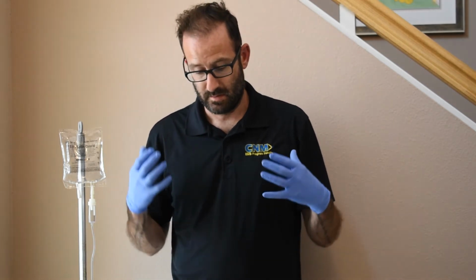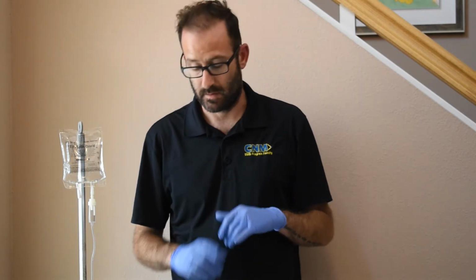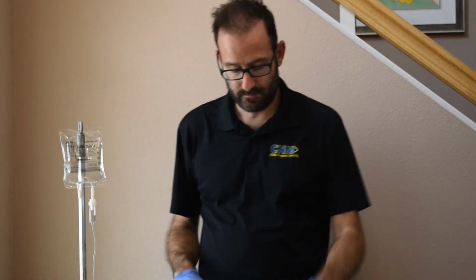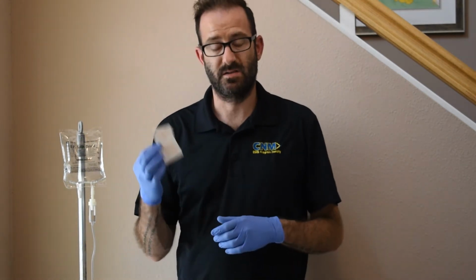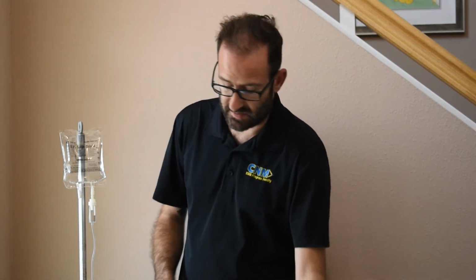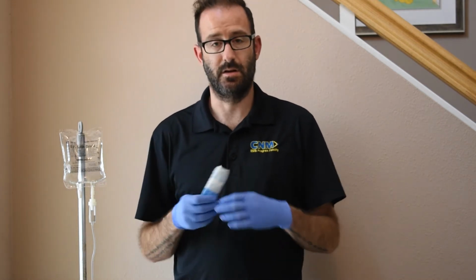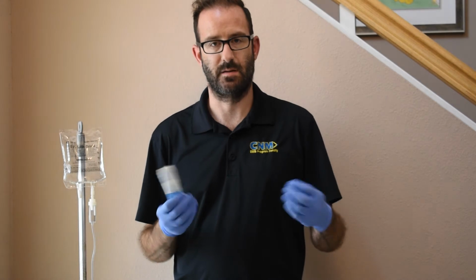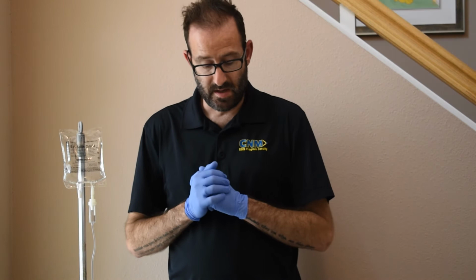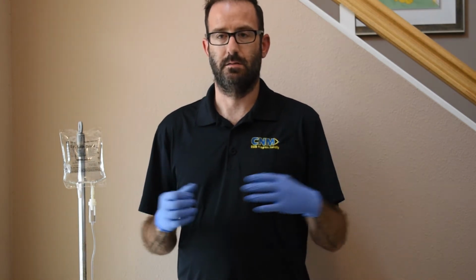We do want to make sure before anything that we have our PPE on. We want to make sure that we have all of our equipment. So I need a patent flowing IV line, a couple of alcohol swab pads, the vial of medication, which we're going to be using Narcan today, and a syringe with either a needle attached, or you can use a syringe and a needle separate and then put those together.